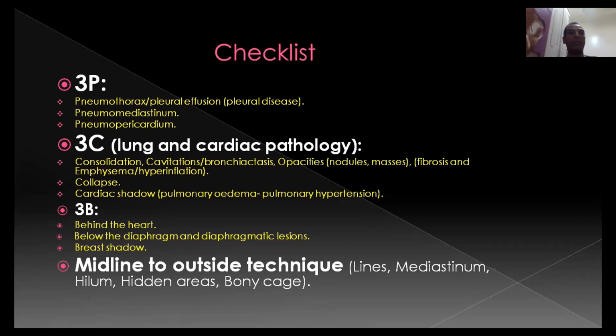It can be diagnosed by CT. If you don't have the ability to do a swab, and you are suspicious whether this patient has COVID or not, you can go to CT. Another indication for CT is a severe case where maybe the swab is negative and you couldn't judge if it's COVID or not. This is another indication, to judge the severity and to confirm whether it is COVID or not.